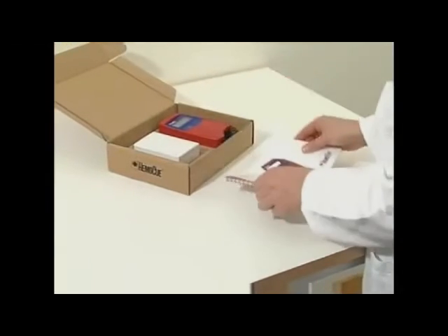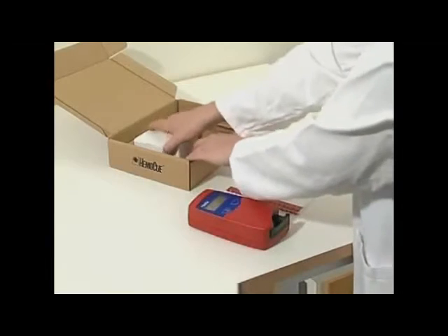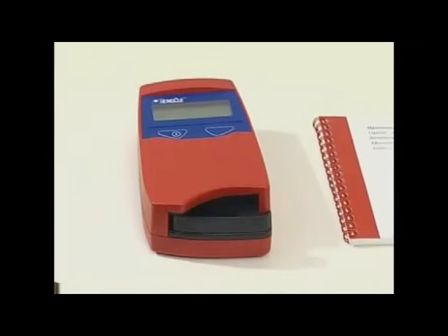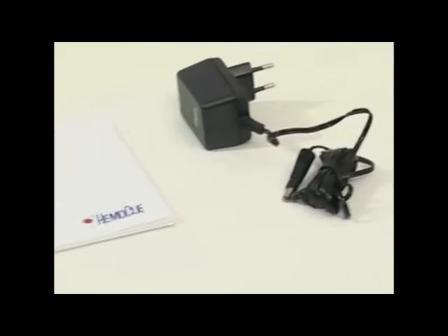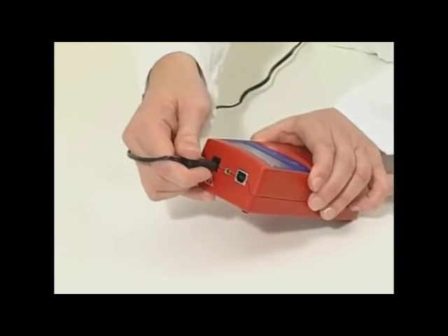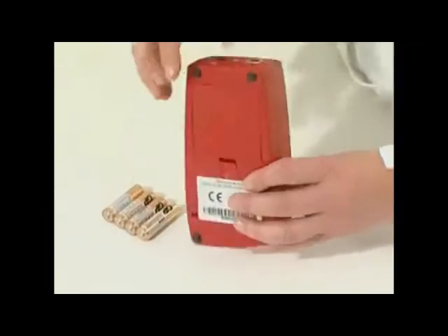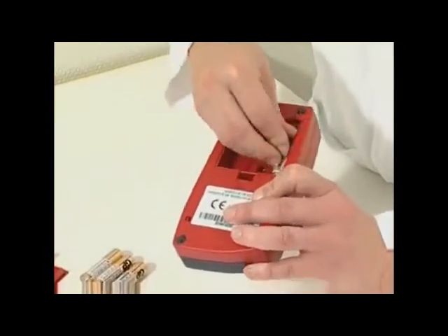The HemaQ 201 Plus analyzer and its mains adapter are delivered in a carton. Open the carton on a stable surface and lift out the instrument and accessories. If mains power is available, connect the adapter to the socket on the back of the analyzer. If mains power is not available, insert the four double-A or R6 batteries into the battery compartment.